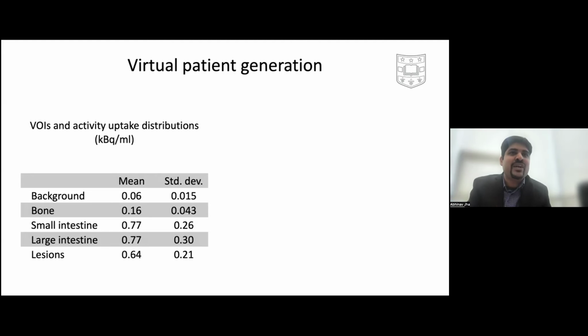And with that, I like to think that we are subjecting patients to things that we don't know whether they will hold or not. But with a virtual imaging trial, you get the confidence that yes, this thing should work. One of the things that I did when I did the actual IRB for the clinical trial that we are proposing in alpha particle RPTs for radium-223 was I took this data and presented it to the committee and I said, look, these methods are reproducible. That's why I think our method should work. And I think they got convinced by that too, that yes, they should work, because it allows the real clinical, real patient study.